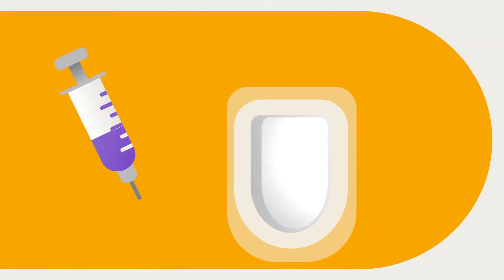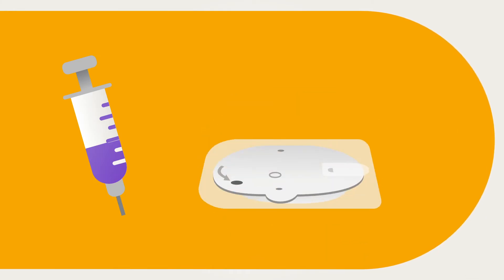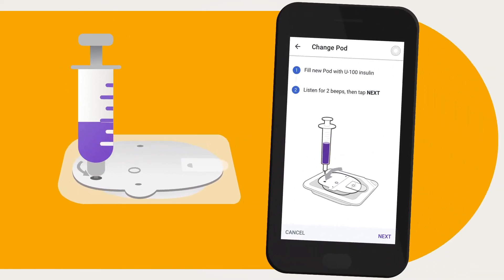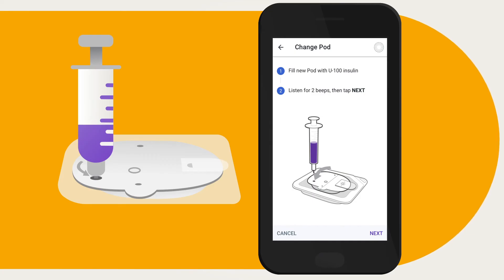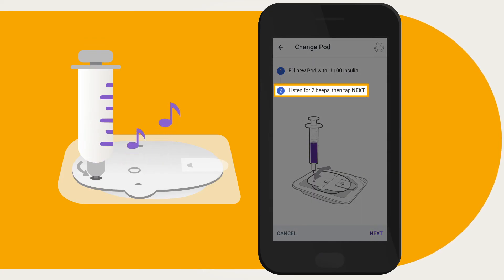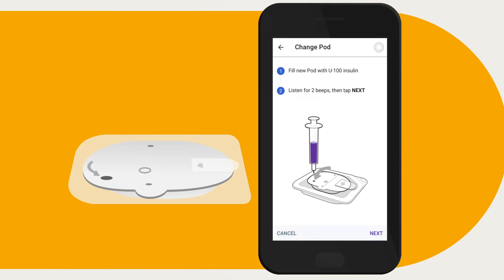Locate the fill port by following the black arrow on the underside of the pod. Keeping the pod in its tray, insert the needle straight down into the fill port and slowly depress the plunger completely to fill the pod. There are two confirmation beeps when the pod is activated — be sure to completely empty the fill syringe even after hearing the two beeps.